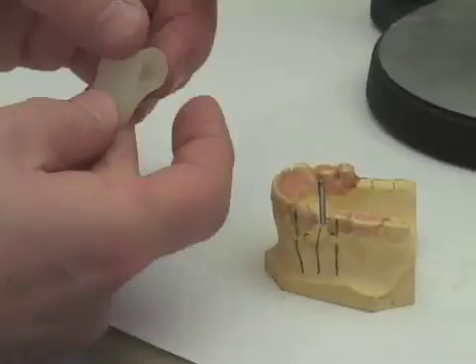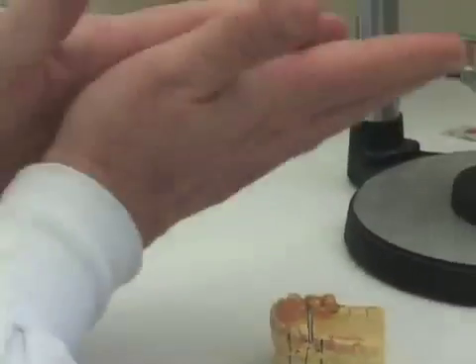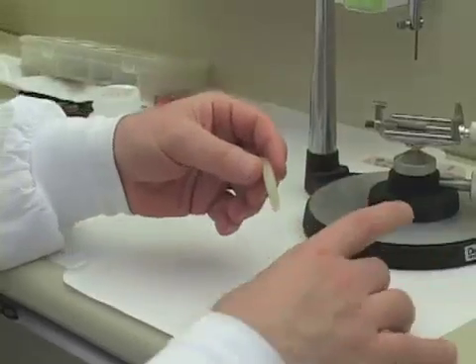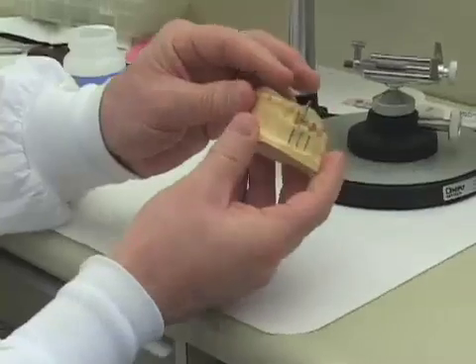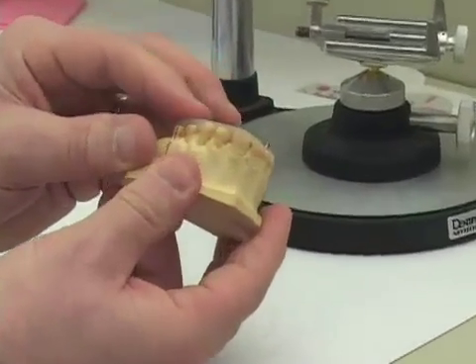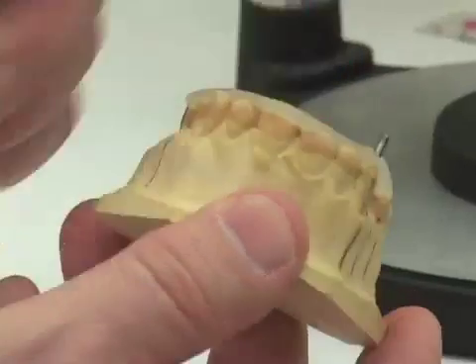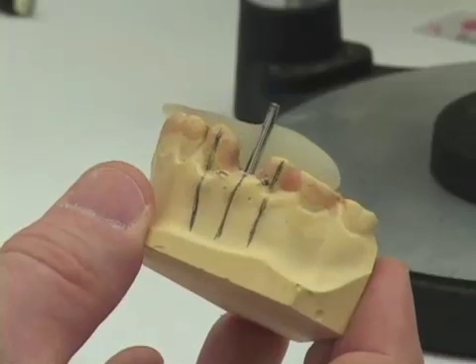I usually take a strip of triad that's about one inch wide, roll it in the palms of my hand until I make an elongated worm, and place it on the occlusal surface of my cast. If I press down with my finger, I'm not trying to wrap it over the buccal or labial of the teeth, but incidentally, if it happens to creep over just a little, that's fine. I do not want the surgical guide to come very far over the buccal or labial of the teeth.